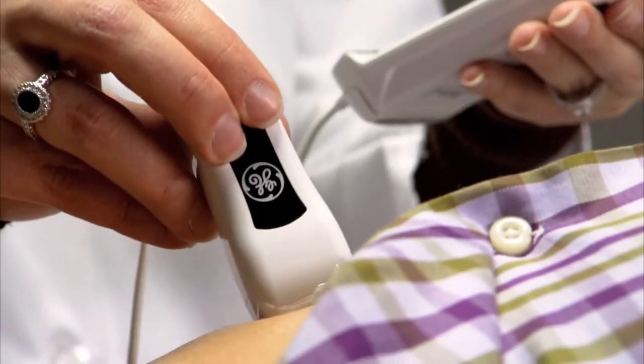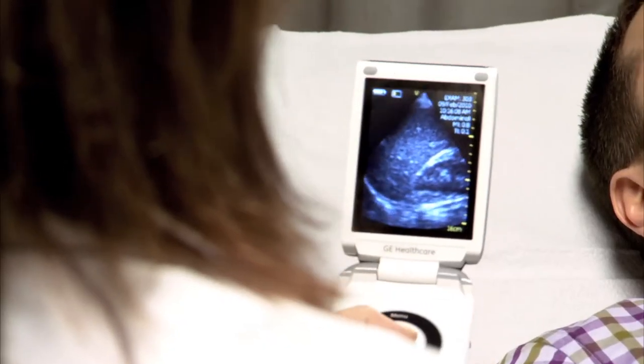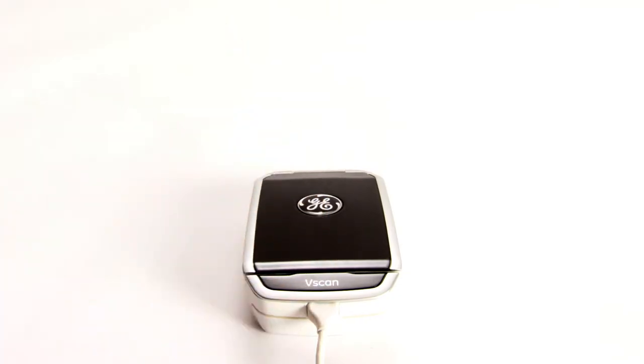We believe that V-scan is going to be used by a vast majority of physicians, whether that's a cardiologist or a primary care physician or an emergency room in Africa.